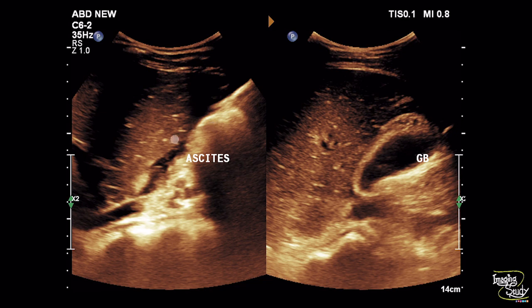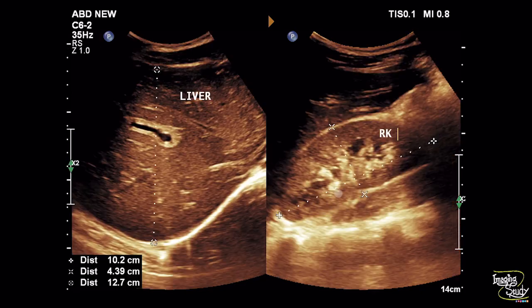We have seen already ascites and gallbladder wall thickening. The kidney and liver are normal in size for this patient. The echogenicity of the right kidney looks a little increased if you compare it with the adjacent liver.